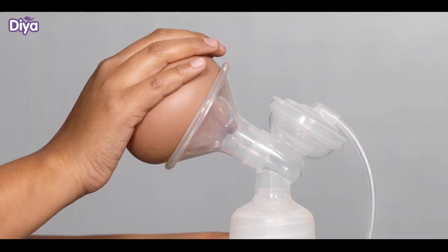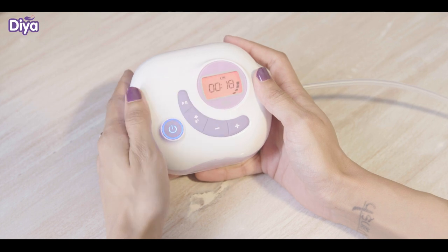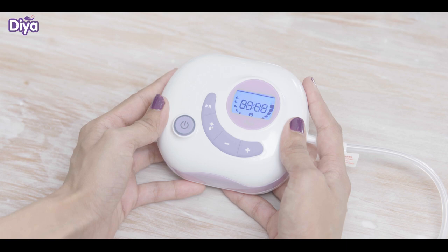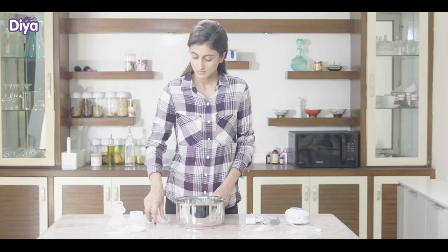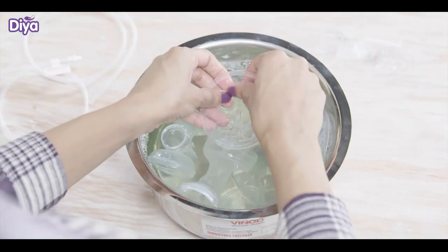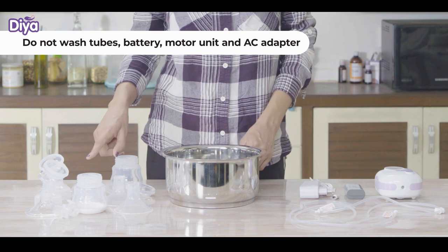You can change the mode anytime with this button. You can press the pause button to pause the machine. Once you are finished, press the on-off button. Once you are done, disassemble all the parts and wash them properly in warm soapy water for next use — except for the tubes, motor unit, battery, and AC adapter.